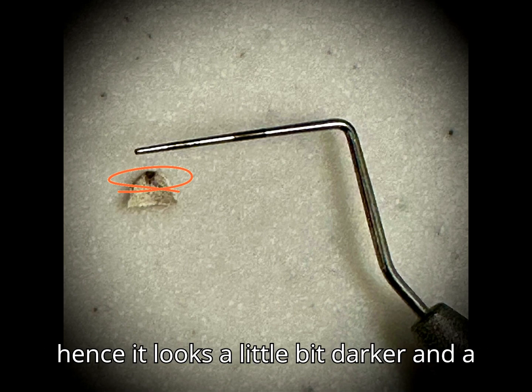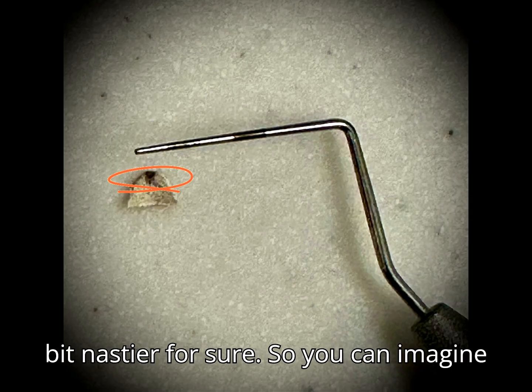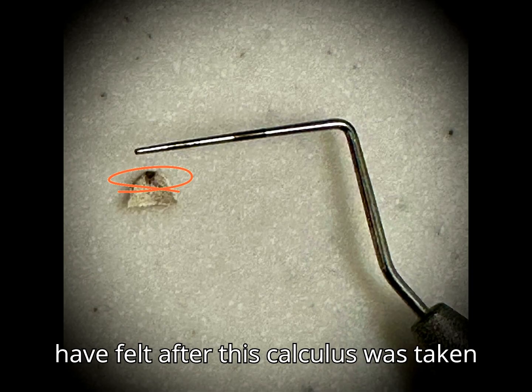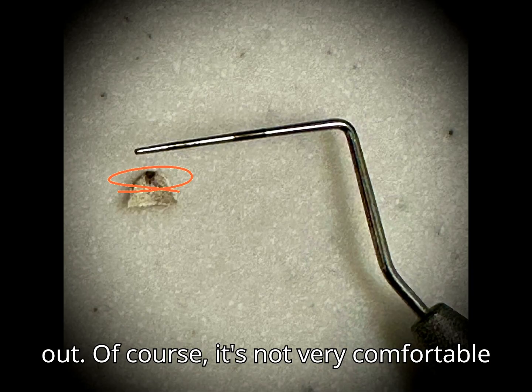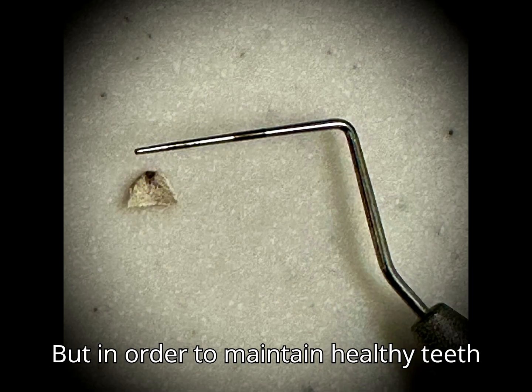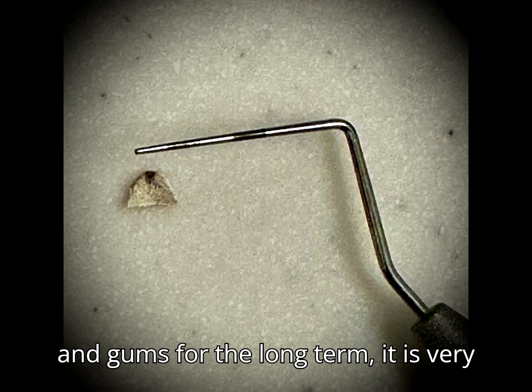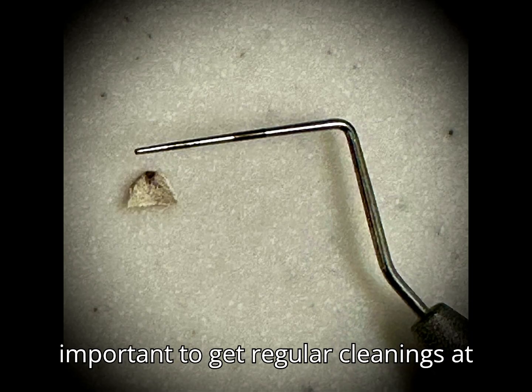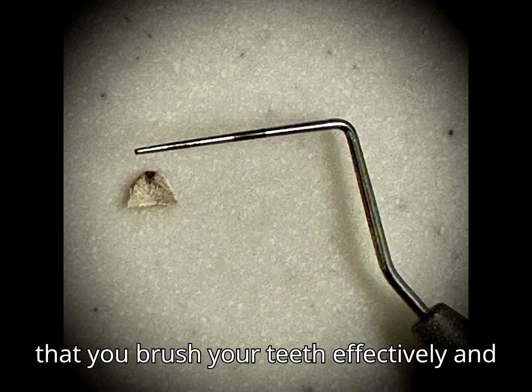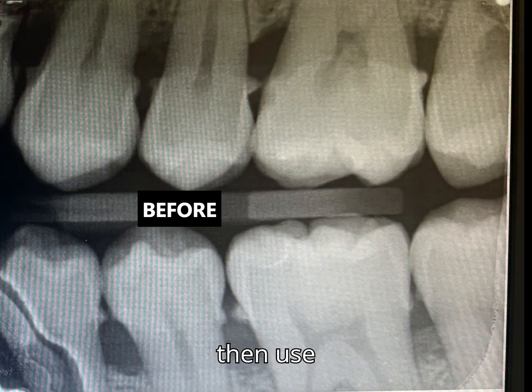Hence it looks a little bit darker and a bit nastier for sure. So you can imagine how relieved this person's gums must have felt after this calculus was taken out. Of course it's not very comfortable during the cleaning process, but in order to maintain healthy teeth and gums long-term, it is very important to get regular cleanings at least twice a year. And what's more important than that is that you brush your teeth effectively and clean between the teeth with the help of floss, a water flosser, or a soft pick.